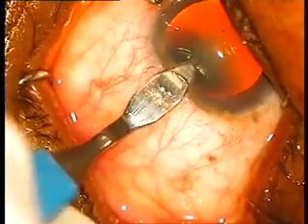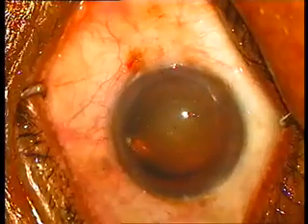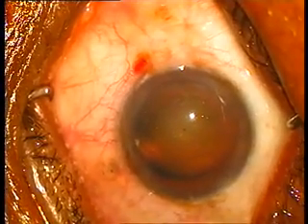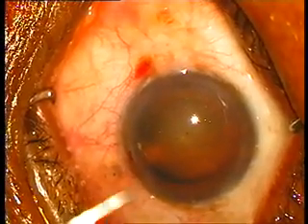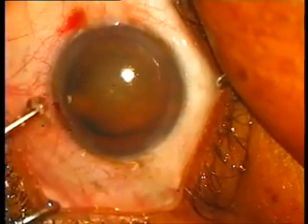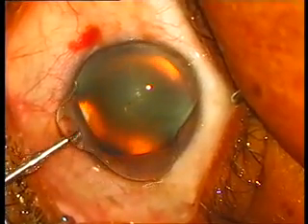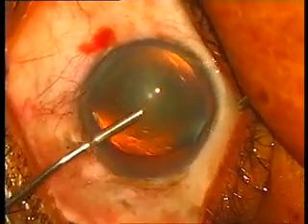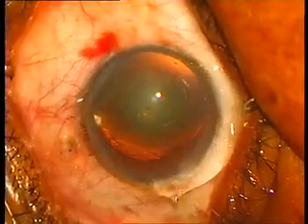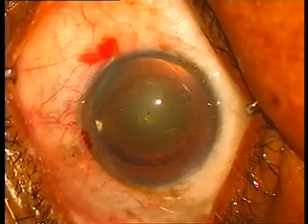If you can see, I'm using a 3mm knife to make the incision in the cornea, and then put some methyl cellulose in the anterior chamber, and also put some methyl cellulose onto the surface of the cornea to keep it wet.